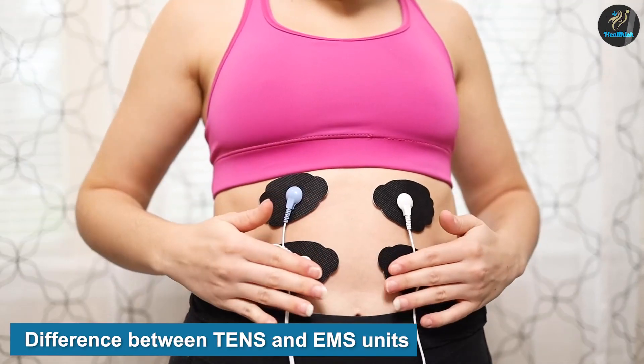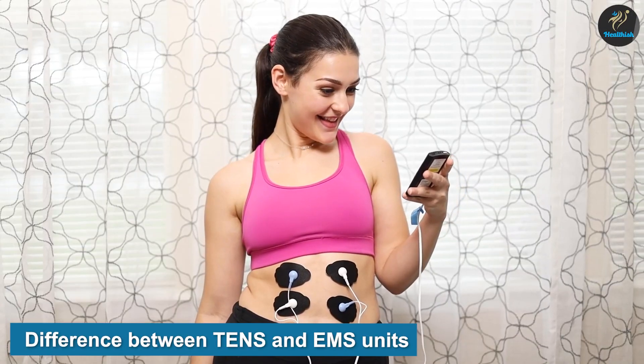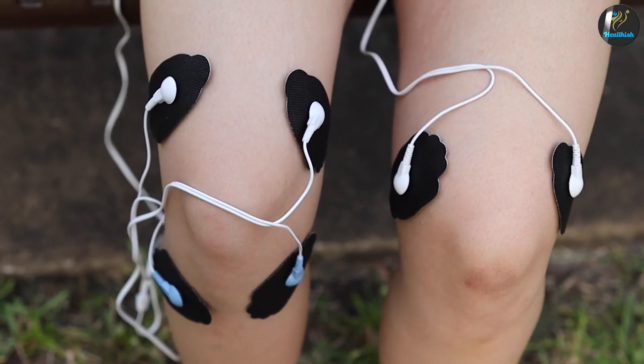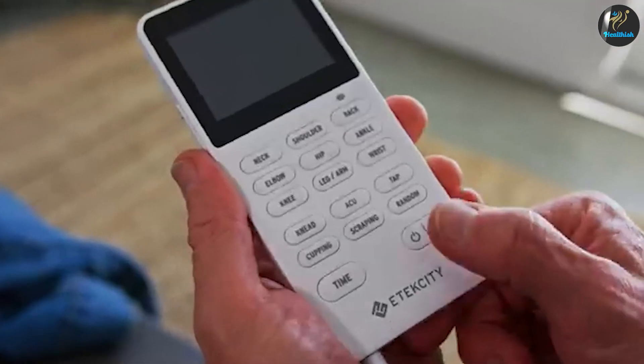What's the difference between TENS and EMS units? TENS and EMS units serve different purposes. However, they operate on the same principle. Both of them involve applying an electrical current to specific areas of your body.